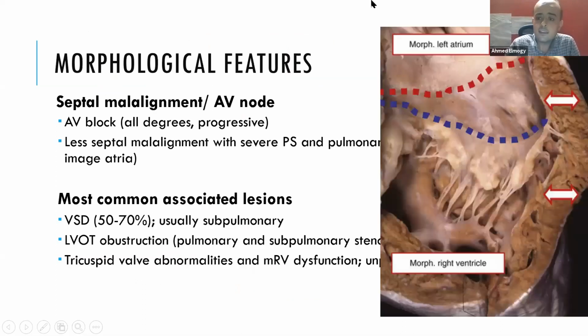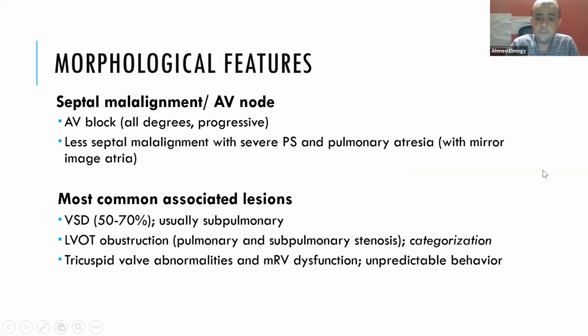Here we can see the tricuspid valve attachments are displaced downwards. However, in this case, we don't say Ebstein's, as the Ebstenoid valve is usually such that the right ventricle is not affected. It's of normal thickness and normal volume.